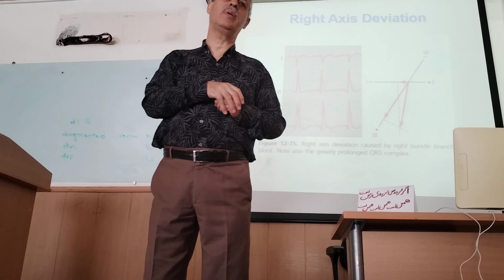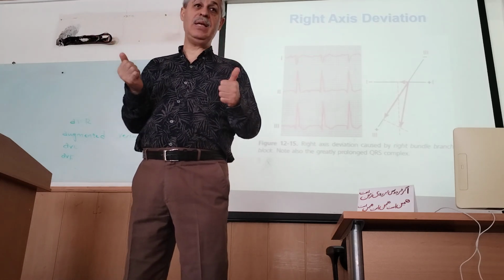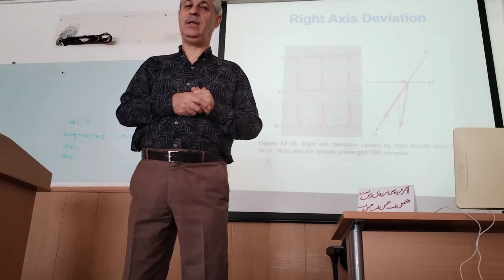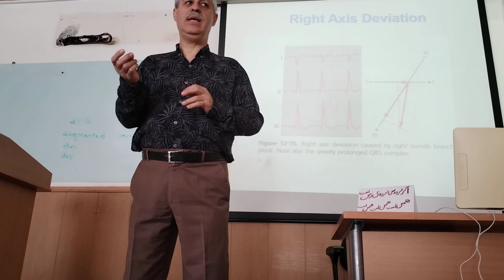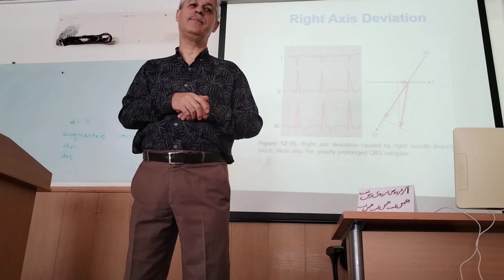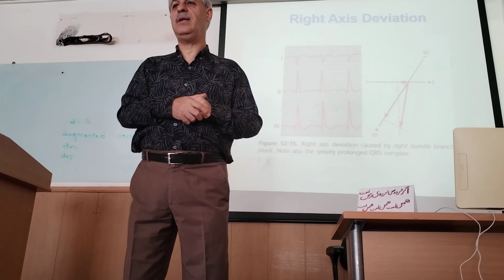Collectively, we have 6 limb leads plus 6 chest leads. These are the 12 standard electrocardiography leads: 1, 2, 3, AVR, AVL, AVF in the frontal plane, and 6 chest leads.